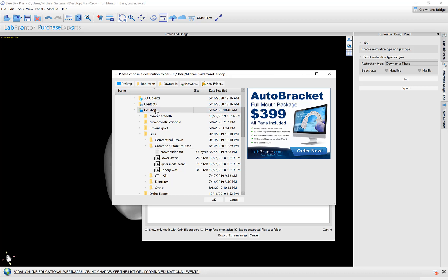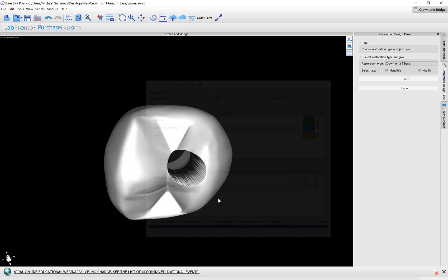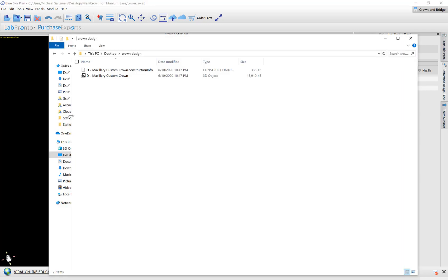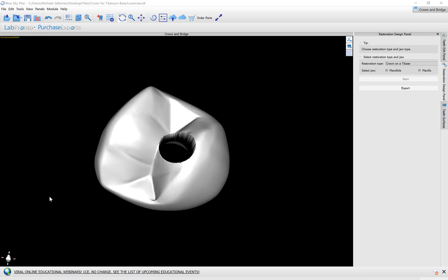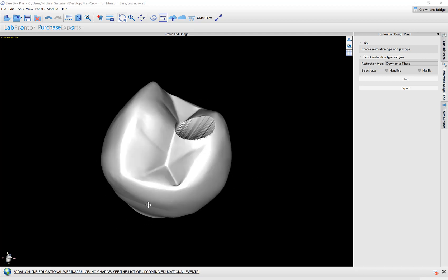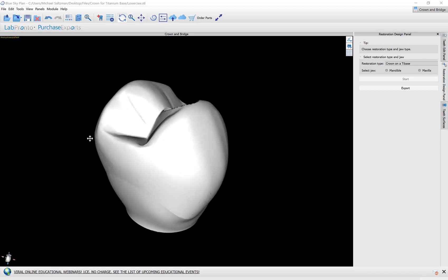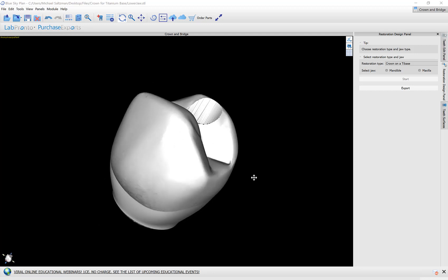I'm going to make a new folder on my desktop. Click the OK button and we can see that the software has exported the construction file for the milling machine as well as the STL file. So that's the process of designing the tooth and generating the XML configuration file.